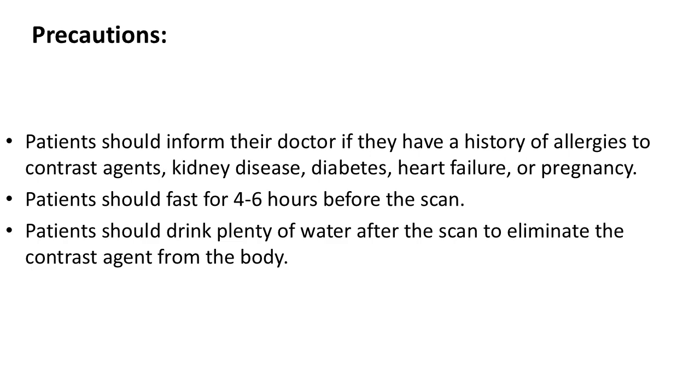Precautions: patients should inform their doctor if they have a history of allergies to contrast agents, kidney disease, diabetes, heart failure, or pregnancy. Patients should fast for 4 to 6 hours before the scan. Patients should drink plenty of water after the scan to eliminate the contrast agent from the body.